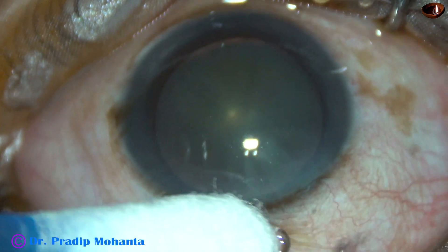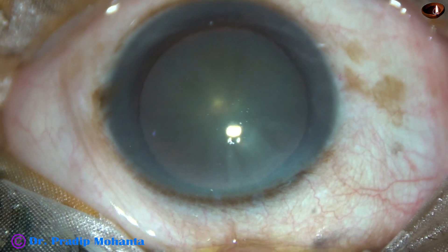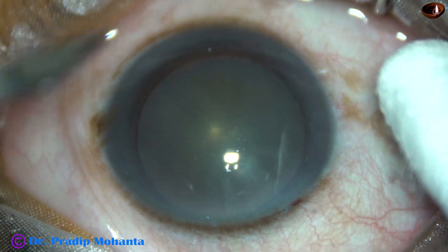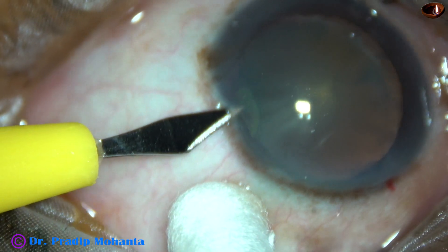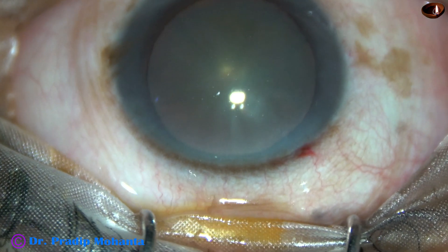This is the main incision with a 2.8 mm steel keratome, and then a side port is made on the left side of the main incision, about 3 clock hours away.